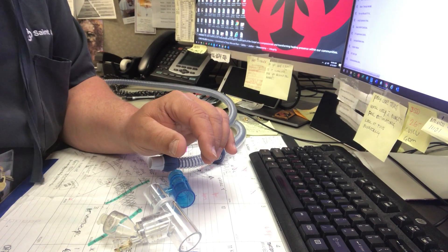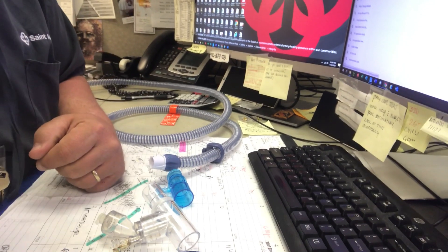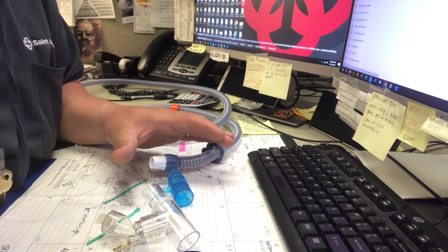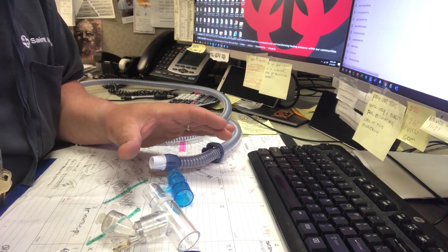Hello RT Types, this is Owen at Boise San Alphonsus, and I'm going to go over rather quickly how to set up an Aerogen on an Airvo high-flow system.